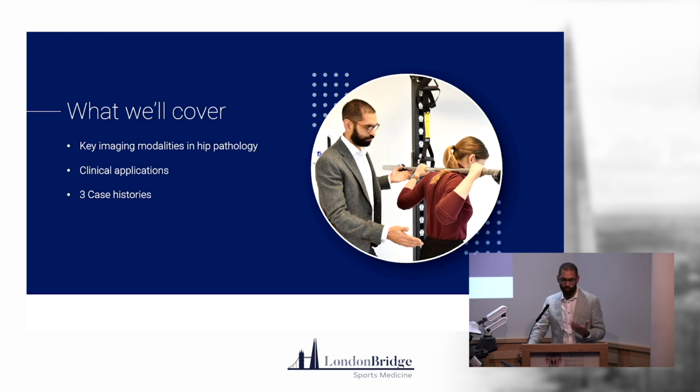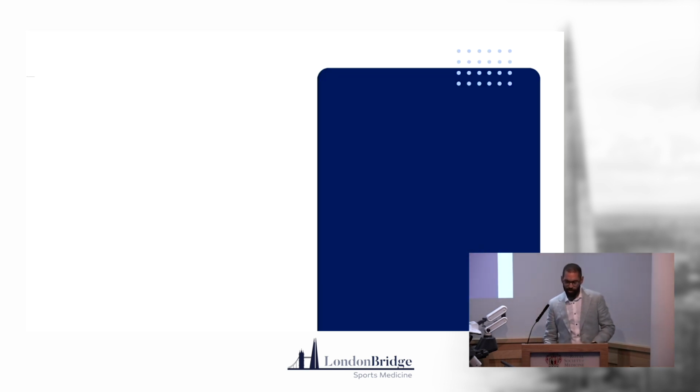So you may clinically examine a patient, and your thought processes about what investigation is needed next completely change. What we'll do is talk through the key imaging modalities with regards to hip pathology. We'll talk about the clinical applications, and finish off with a couple of case histories at the end and try and put it all together. So let's start off with X-ray.